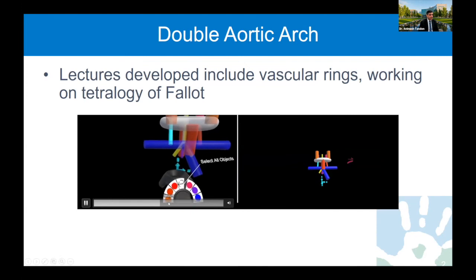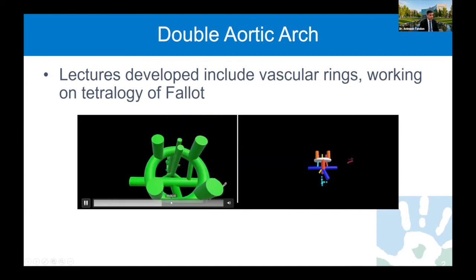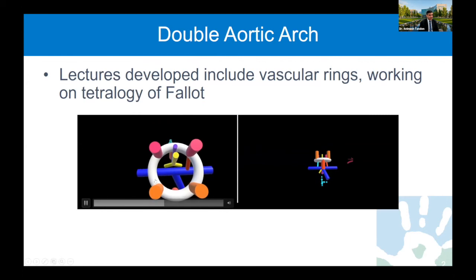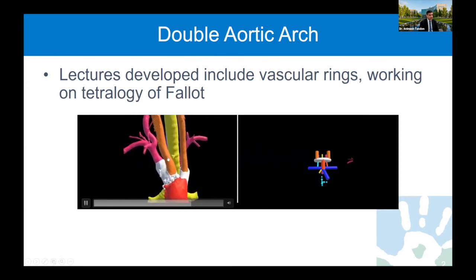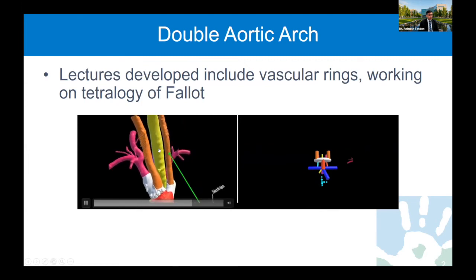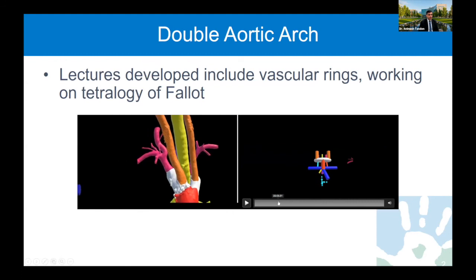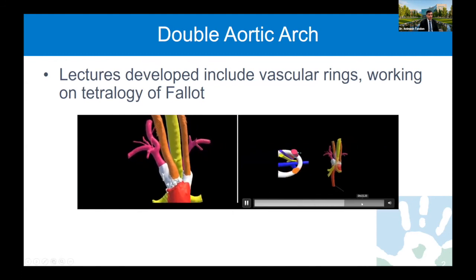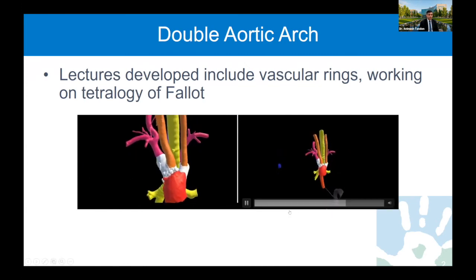So we actually created some virtual reality videos that will be available on YouTube soon about vascular rings. We created an idealized vascular ring, like this Edwards model of it. And then we use patient-specific anatomies as well, kind of like what Dr. Adebo described, to show this anatomy in depth. And then here's another example of this for looking at double aortic arch.